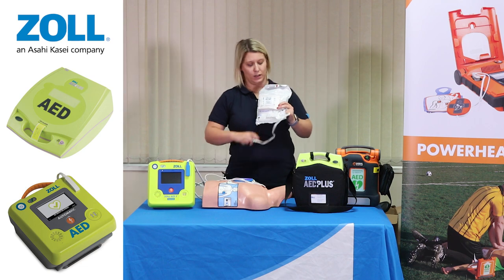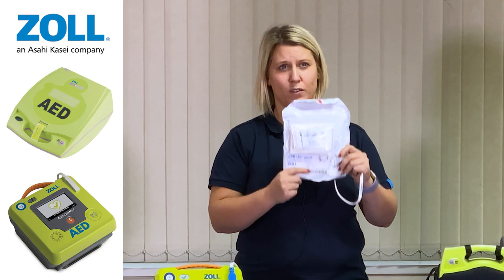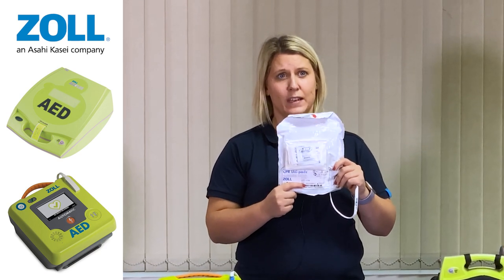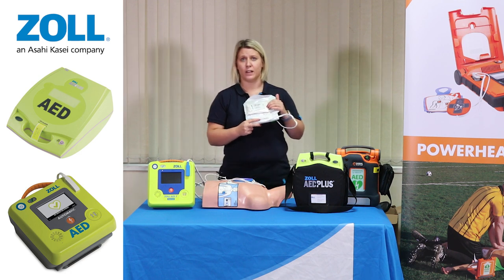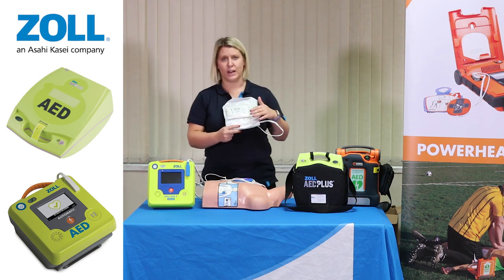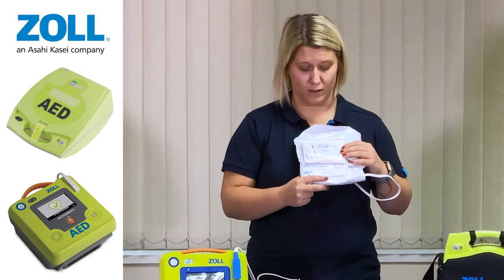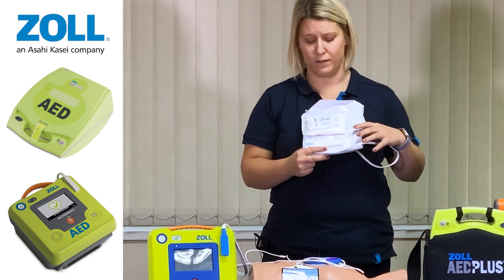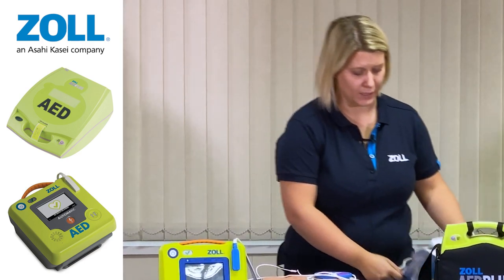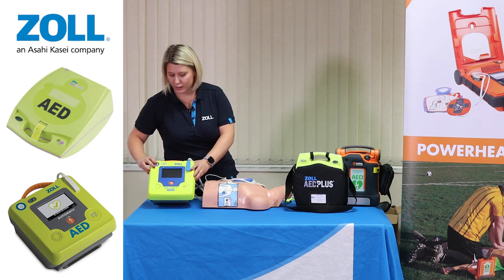You've also got a rescue ready kit in the back of the pads. This comes with every set of replacement pads for the AED3 and the AED Plus, and it includes a napkin in case the patient has sweated profusely or vomited, a razor for a dry shave, some cleansing wipes, and gloves to maintain a sterile environment as much as possible. We've also got a face shield in there should you wish to do mouth-to-mouth while delivering CPR.